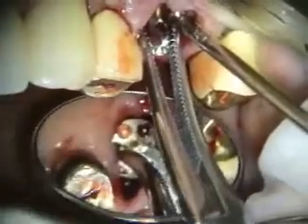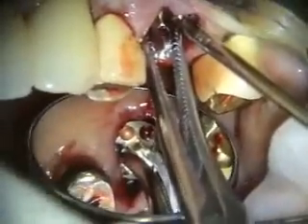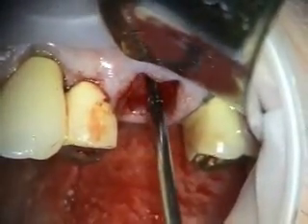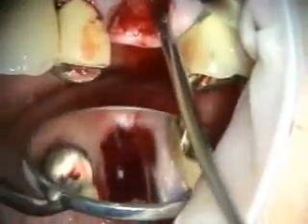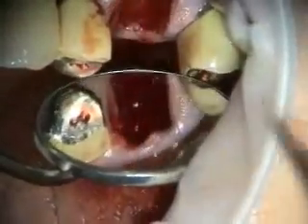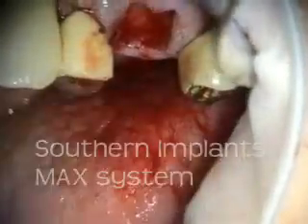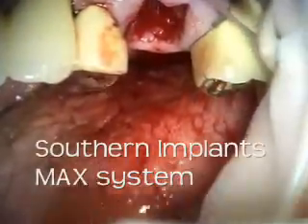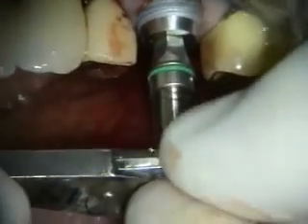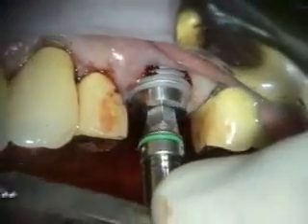Okay, so we got our 8x7 try-in. Here we got our tooth out and our osteotomy made for this implant. It's an eight by seven max.